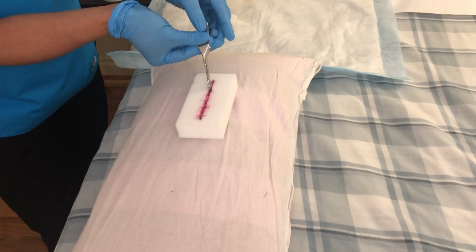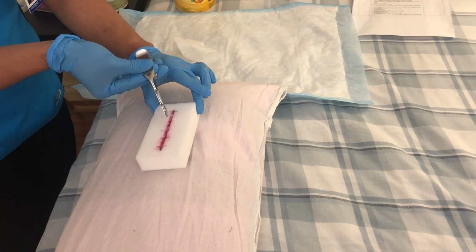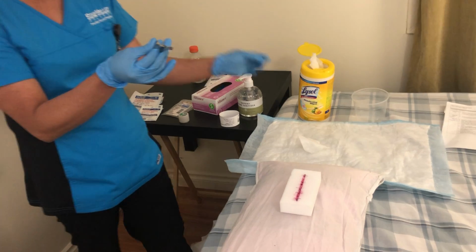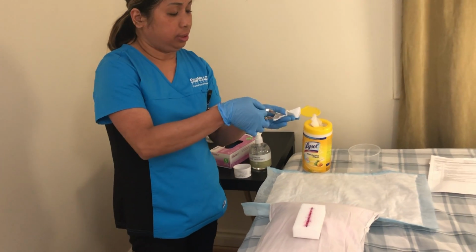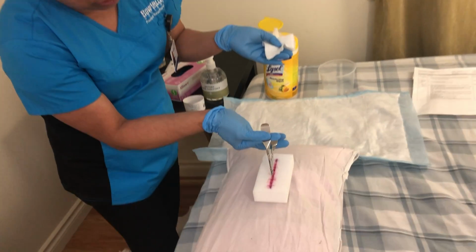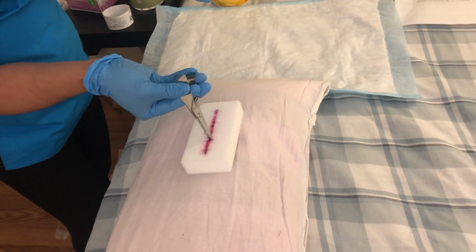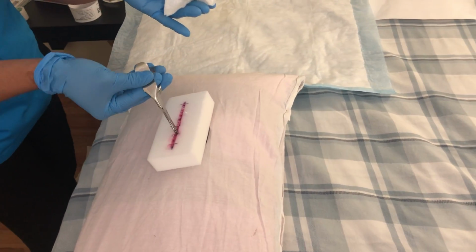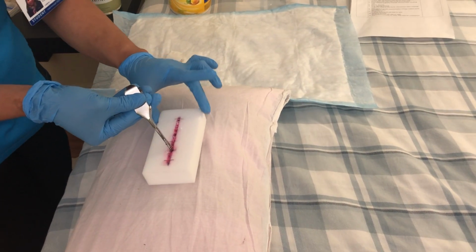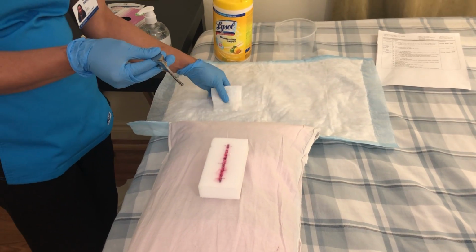Then pinch, then gently wiggle, wiggle, wiggle, and now this one is removed. I'll put it here. Next is the fourth one. Two teeth under the staple, then pinch, slowly wiggle, wiggle, wiggle. Okay, I'll put that one there too.